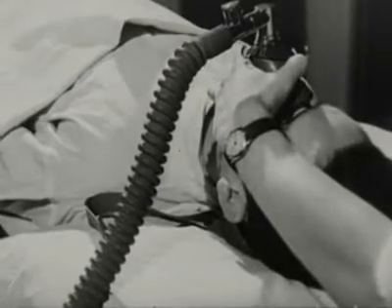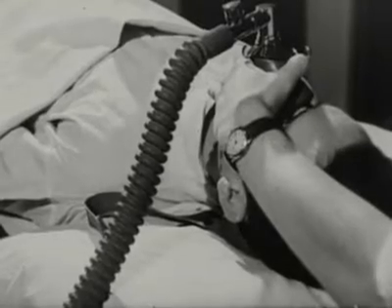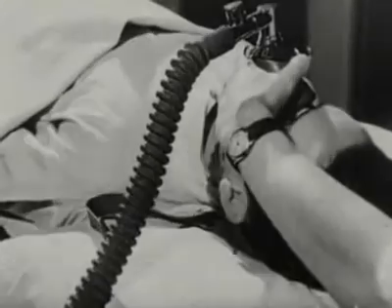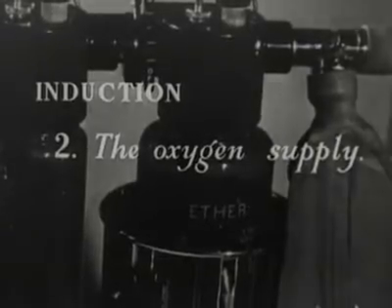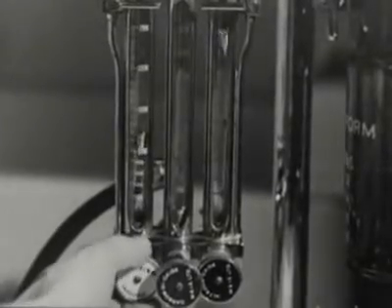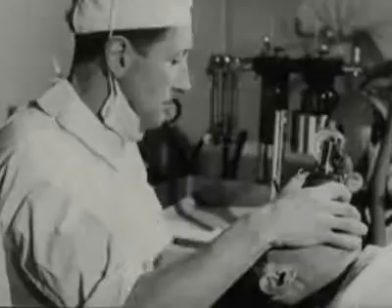The onset of the third stage of anesthesia is marked by regular and sometimes stertorous breathing, often a sign of lack of oxygen. Now turn the oxygen on to 1 liter per minute. Provided the airway is clear, this will be sufficient for the 5 minutes or so until the ether has been brought in.